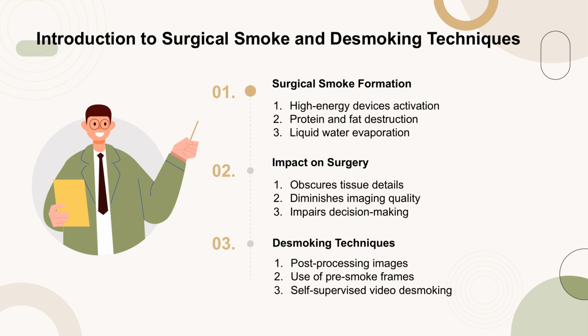Surgical smoke is generated during surgery due to the activation of high-energy devices, leading to the destruction of proteins and fats and the evaporation of liquid water. This smoke obscures tissue details, diminishing the quality of laparoscopic imaging and impeding surgeons' ability to make informed decisions. To address this, post-processing laparoscopic images for desmoking has become an effective method. Additionally, the use of pre-smoke frames and self-supervised video desmoking techniques are being explored to improve visibility during surgery.